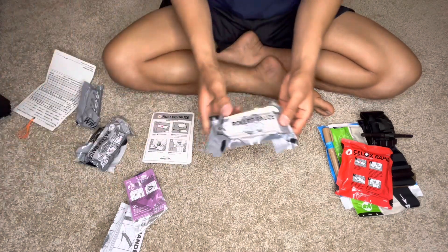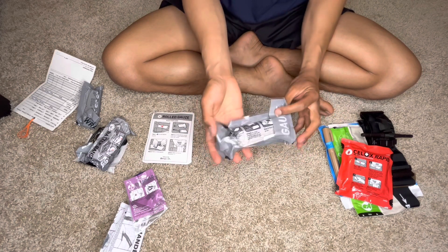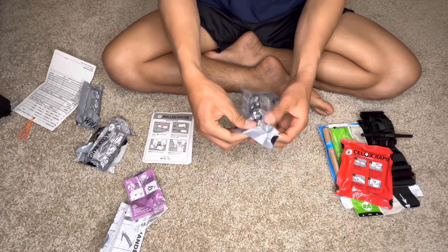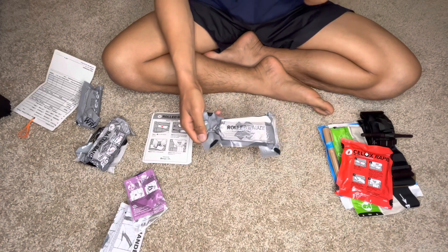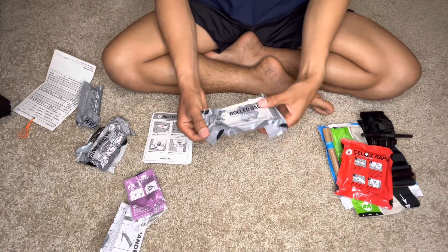Next one will be the rolled gauze. As you can see, it's still packed and sterile, and it's actually thicker — it's designed for combat, it's a tactical individual first aid kit.